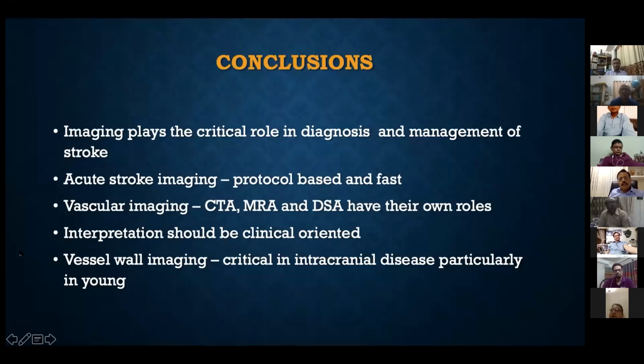Vessel wall imaging is emerging as very critical in intracranial disease diagnosis, particularly in young patients, to look for all the differential diagnoses.